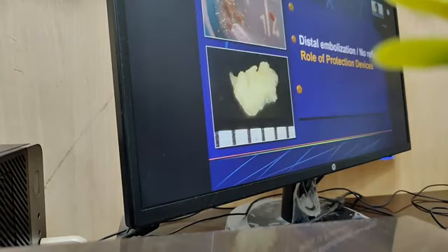even in saphenous vein graft. So the second challenge of saphenous vein graft intervention is distal embolization. The graft is full of thrombus and degenerative material, and this goes distally and causes no reflow. The whole purpose of doing angioplasty is lost, and therefore we have to have something.